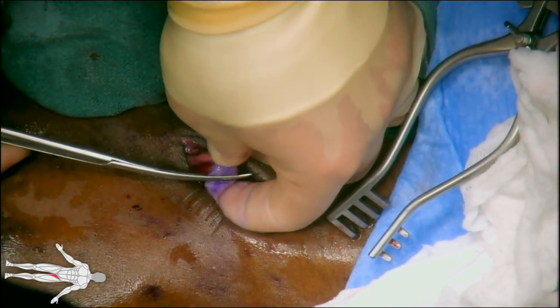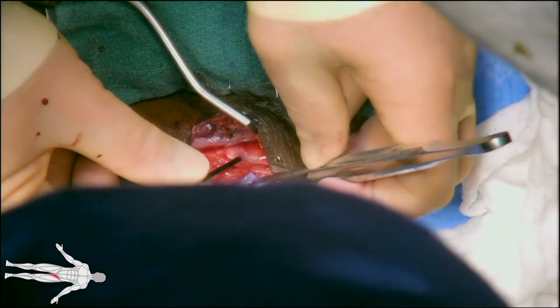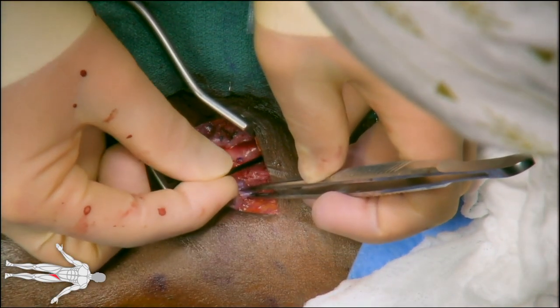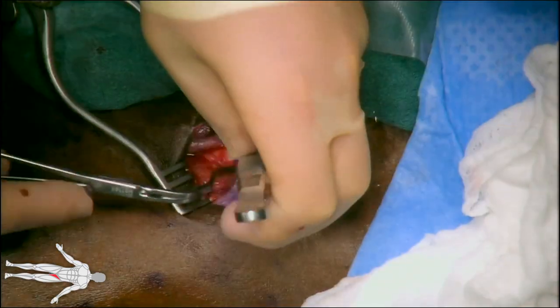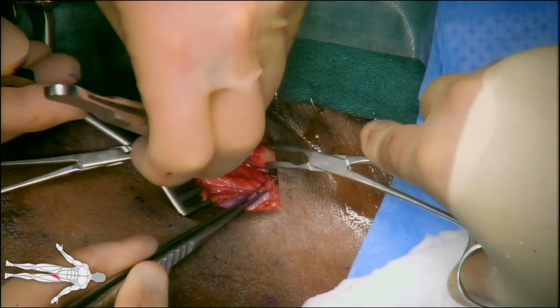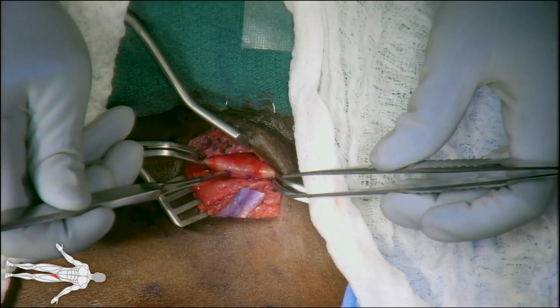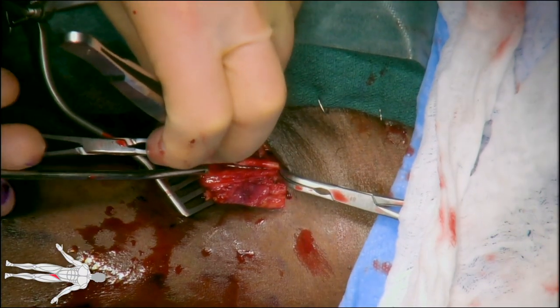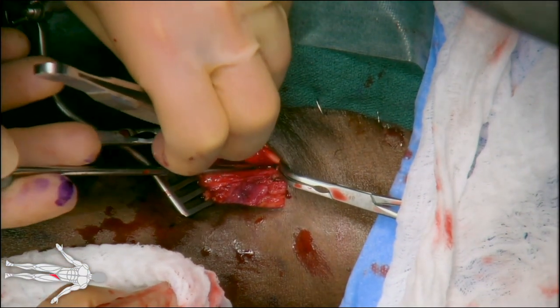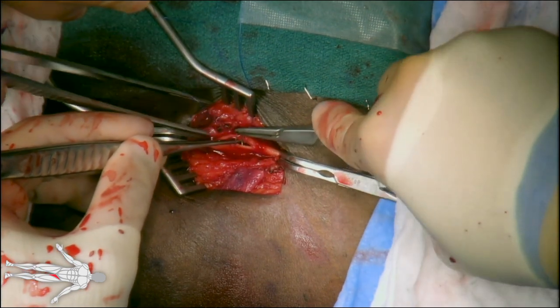Next the graft is beveled at its arterial end to perform our end-to-side anastomosis. The common femoral artery is then marked for our arteriotomy, and this is followed by placement of distal and proximal clamps. An arteriotomy is then made with an 11 blade and extended with Potts scissors. This is followed by placement of stay sutures on the common femoral artery.